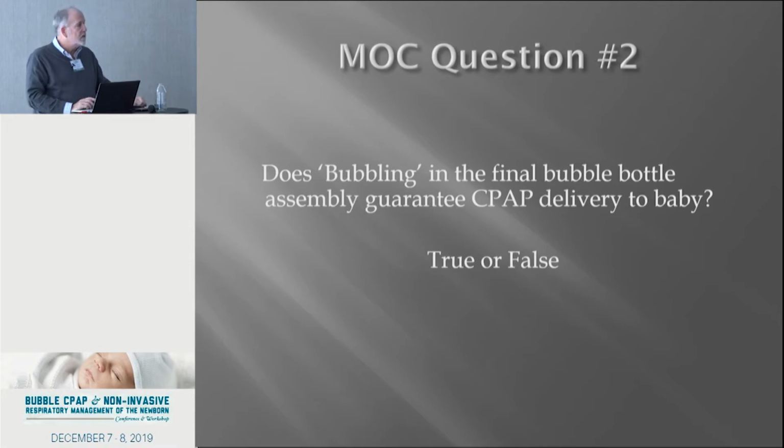And last but not least, it's been said, I've heard it a couple times in this day, is never trade FiO2 for CPAP. Now, I work in a facility where they don't use bubble CPAP currently. Maybe they never will, but they use Vapotherm and they do the same thing, and they turn the flow down and they turn the FiO2 up. And I said, what did you gain? You increased a possibly toxic drug. Does that sound good? Doesn't sound good to me.